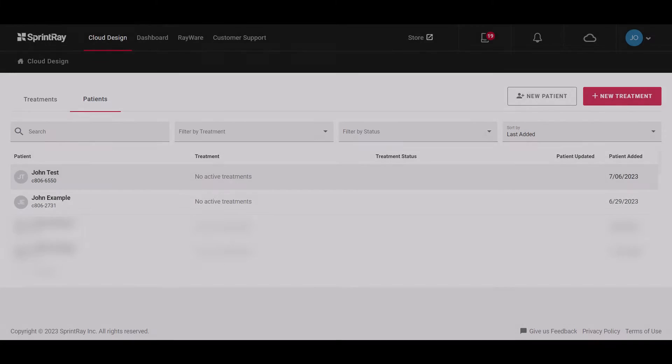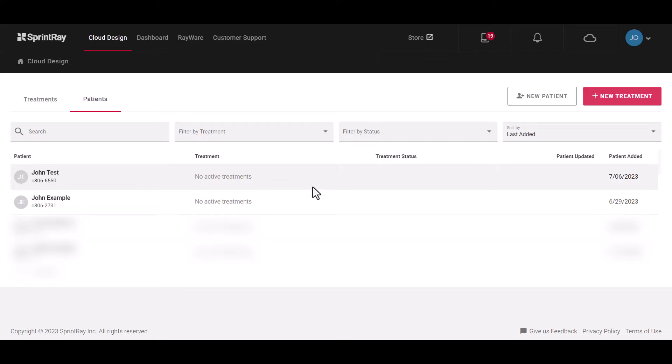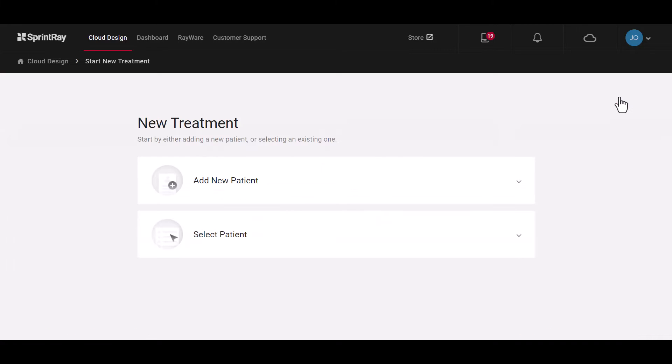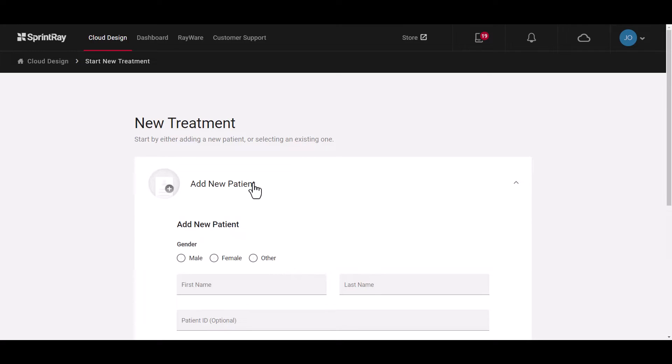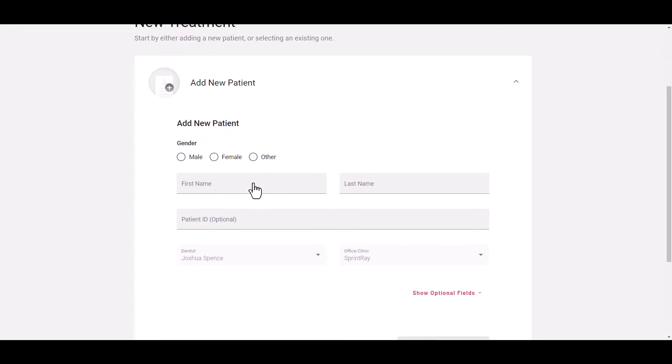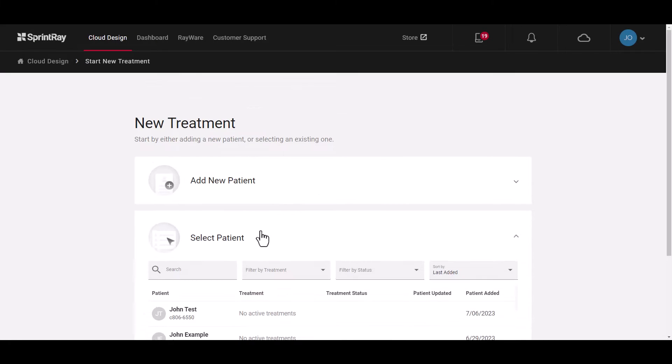Here you can start a new treatment directly from the patient page or from the home page you can select new treatment and choose to add a new patient from here or you can select an existing patient from your patient list.